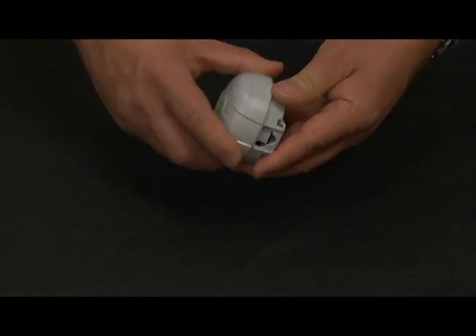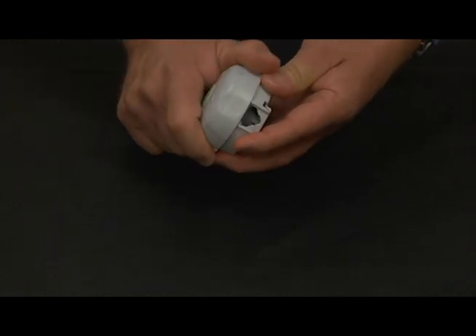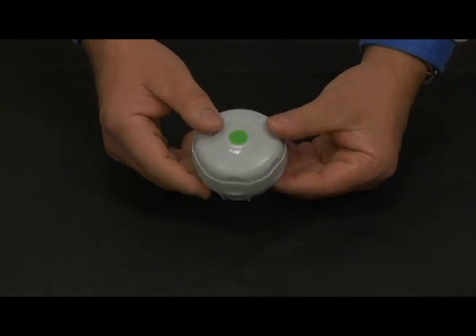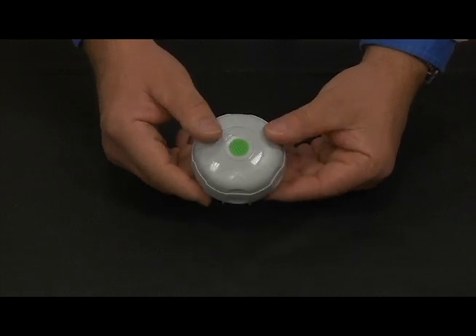Grab the base of the membrane changer with one hand. Turn the top clockwise with the other hand to the next stop. Verify that the arrow aligned with the hole points towards the green center dot.